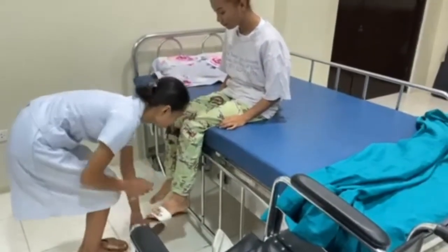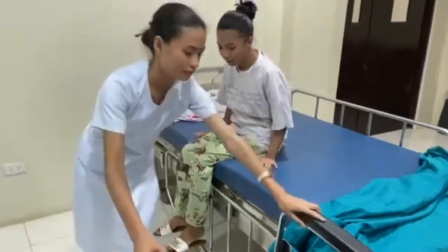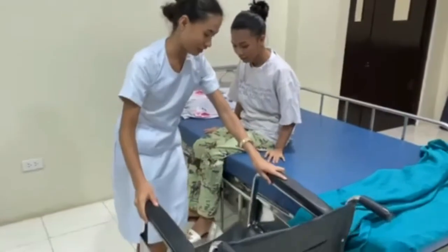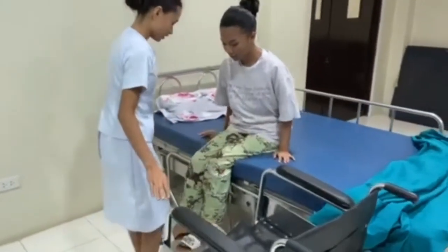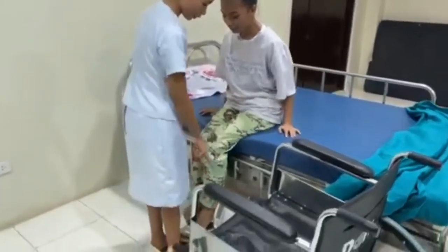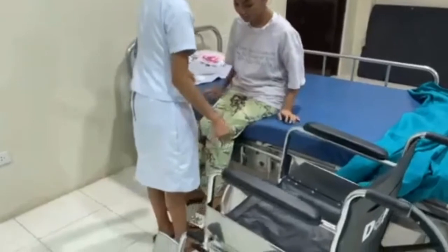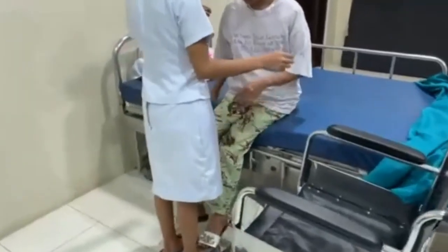Assist the client in putting on a bathrobe and non-skid slippers or shoes. Place a gait or transfer belt snugly around the client's waist. Step 3. Give explicit instructions to the client. Ask client to move forward and sit on the edge of the bed or surface on which the client is sitting with feet placed flat on the floor.